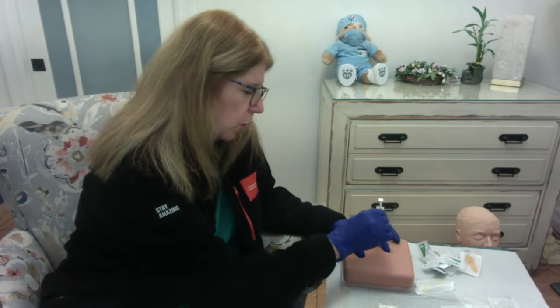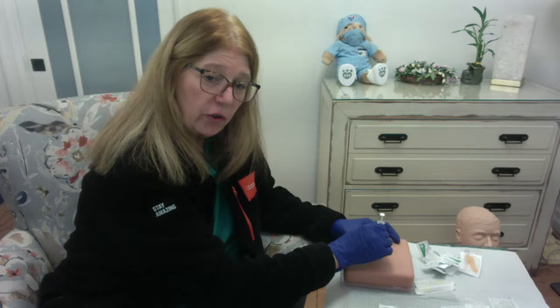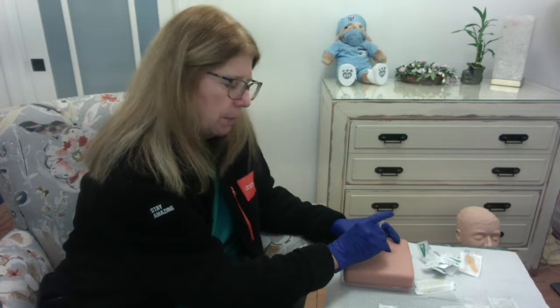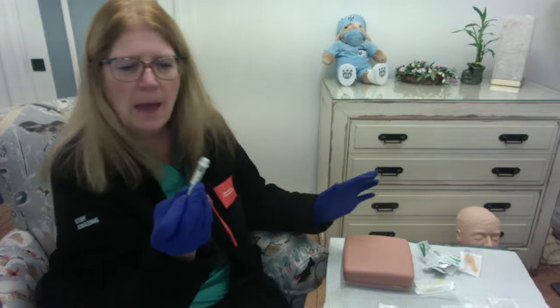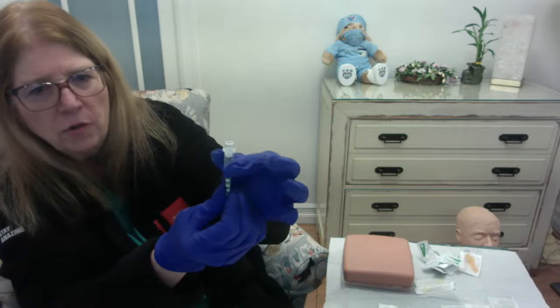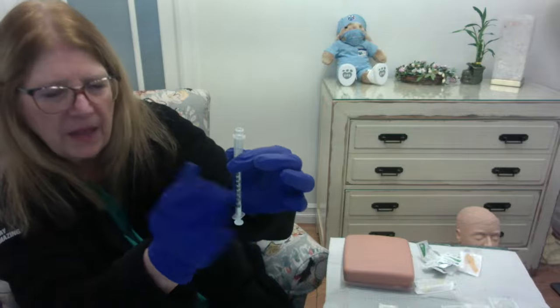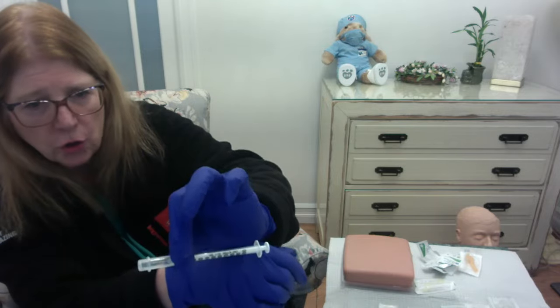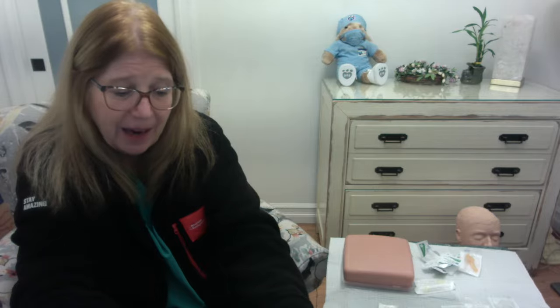You are going to go in at that 90-degree angle. You're going to hold that syringe steady. You're going to move a finger up to the plunger, push the plunger, release the skin, take out the needle. And in this instance, we can engage that safety, right, to cover up that needle. I'm not going to click it into place because I want to use this over again, but at the end I'll show you. But you're going to pull this up and click it, and then it's going to go in your sharps container, okay? So that is our insulin at 90 degrees.